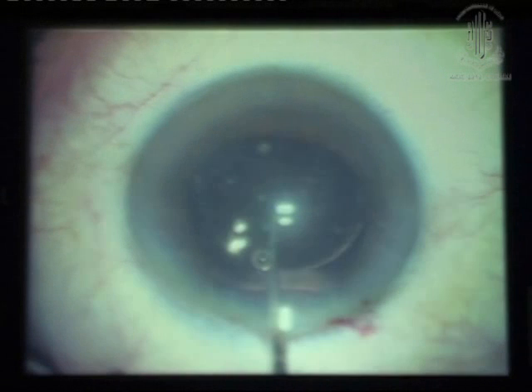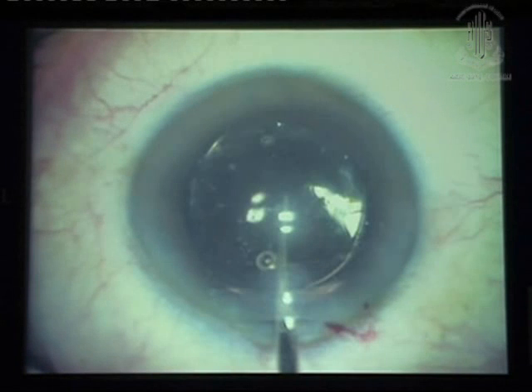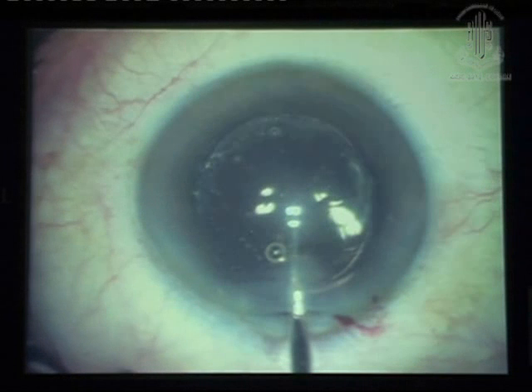However sure you are that your sulcus diameter and IOL diameter match, it's always better that you do a rhexis capture so you get this fusiform appearance. This is the appearance you get. That ensures centration for life.